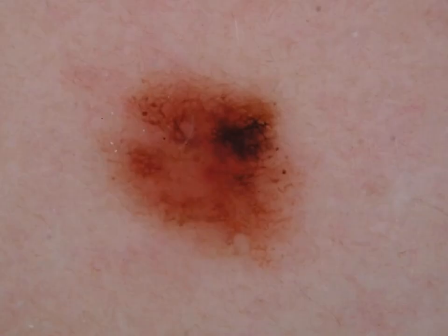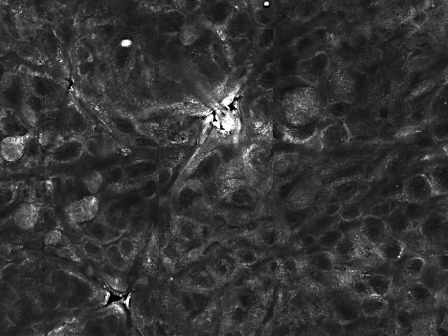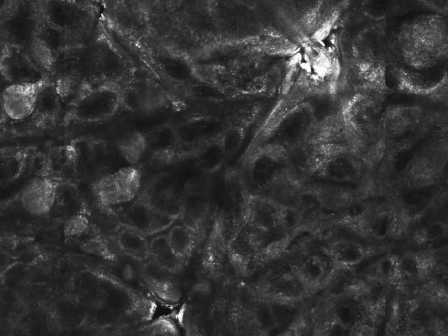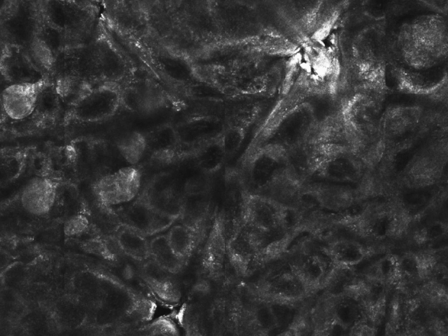Here is an example of an atypical mole. At confocal, the architecture is regular, and at close-up no cytological atypia is visible, leading to the diagnosis of melanocytic nevus.